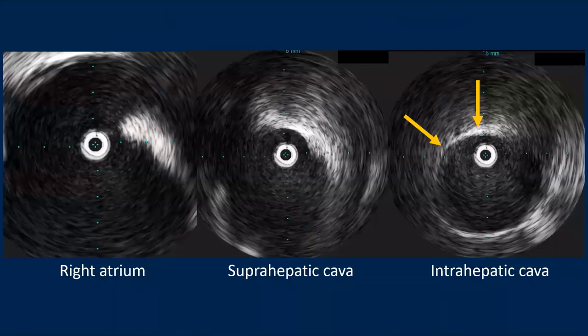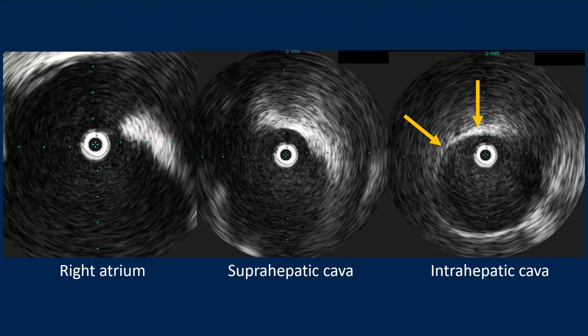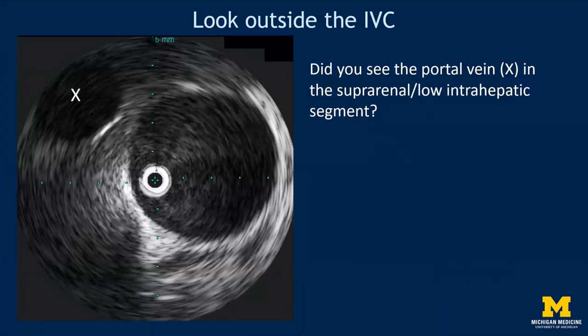Starting from the top on our case example: the right atrium is a large anechoic pulsating structure. As you transition to the intrahepatic cava, you'll notice that the liver echo texture surrounding the cava starts to change. The liver parenchyma and that liver echo texture will provide an acoustic interface that makes the IVC wall appear as a thinner echogenic band, as seen on this right-hand image. Here you can see a still image from the low hepatic cava with the main portal vein at the 10 o'clock position — similar to other extracaval landmarks, this can help identify where you are in space.